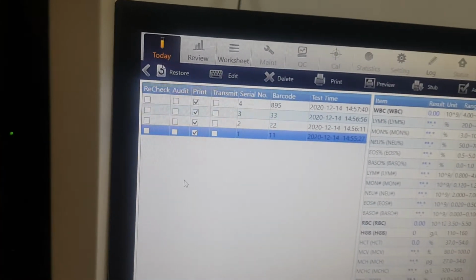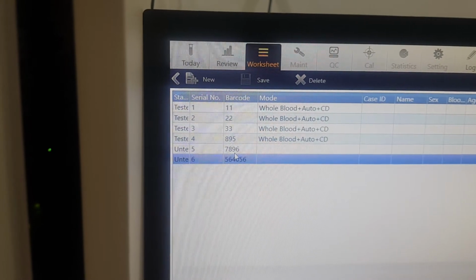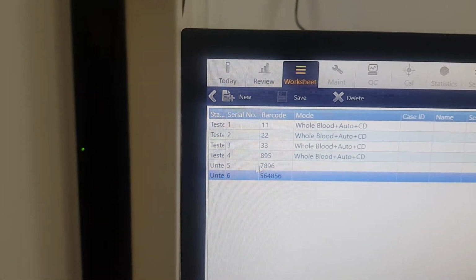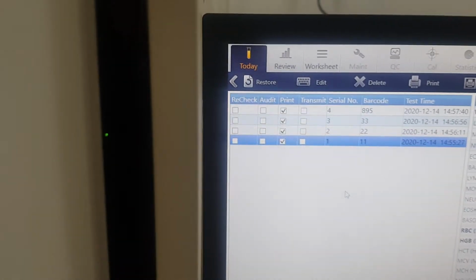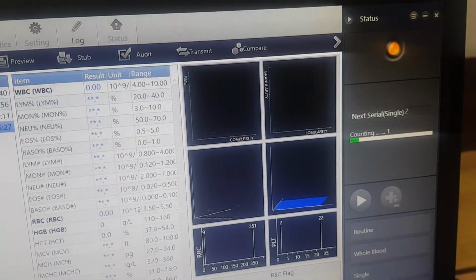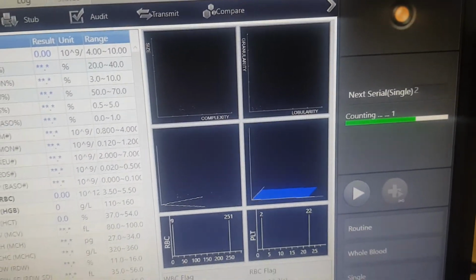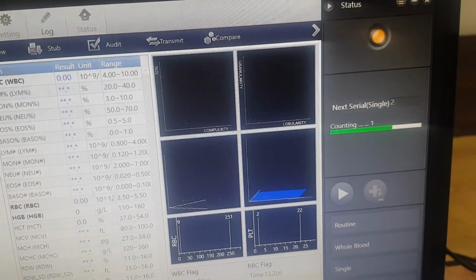Now here we should have position number, serial number 5, and ID number this one, but we will see what it will show. See, the next run number already changed to 2 and it is counting from number 1. It is counting from number 1.